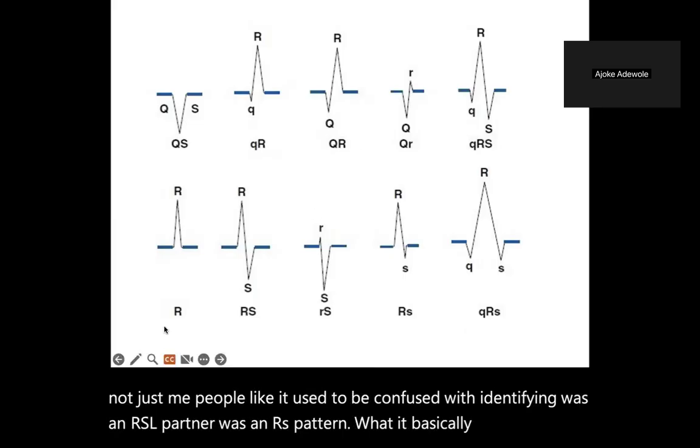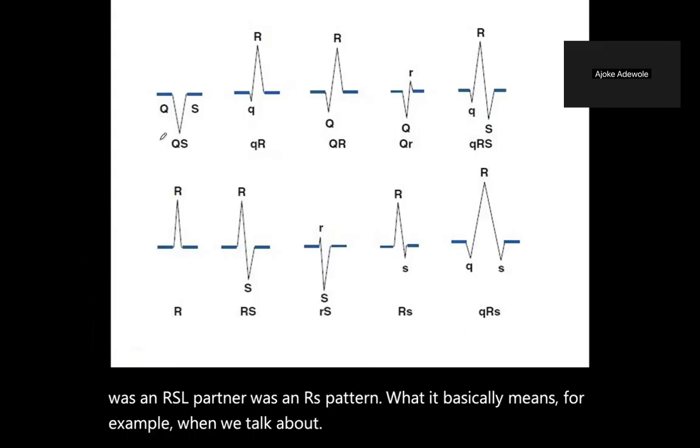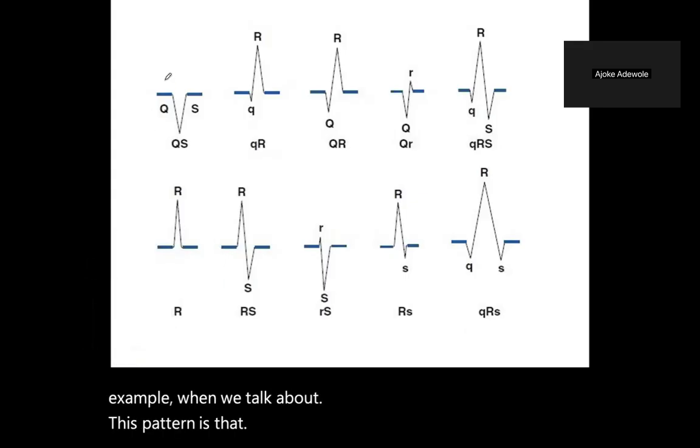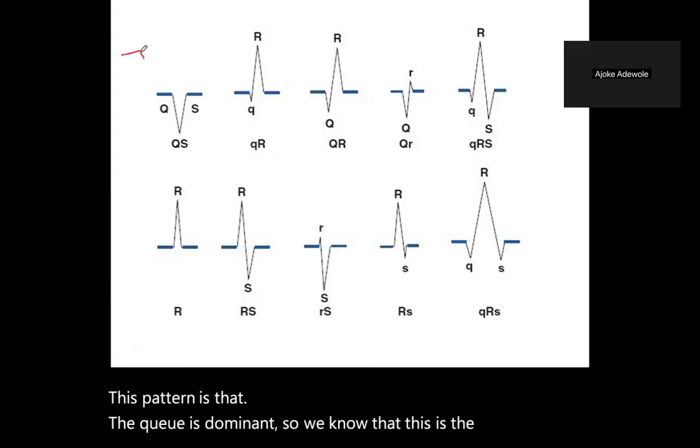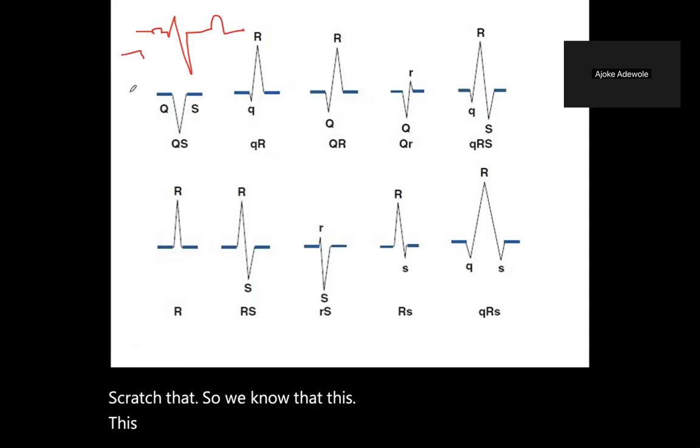For example, let me scratch that. Just permit the inaccuracy of the drawing, but this is what the normal wave would look like.